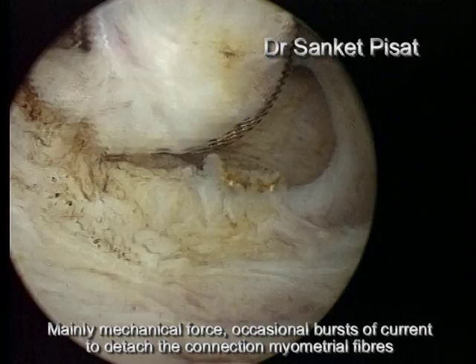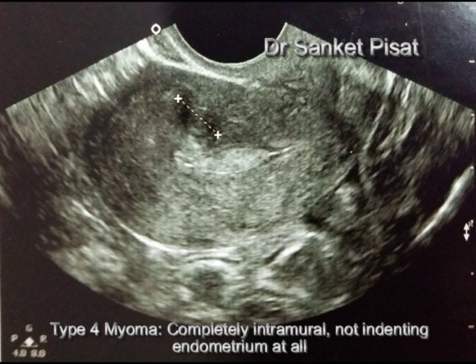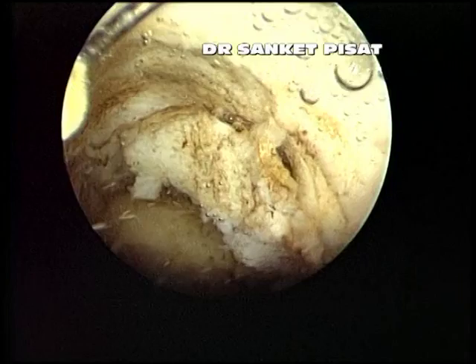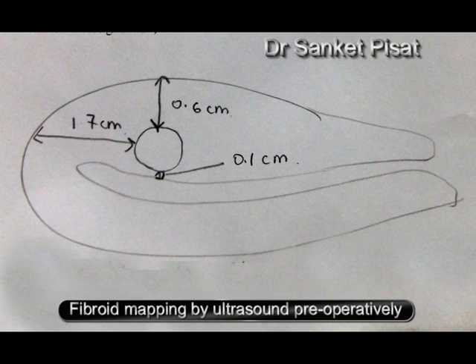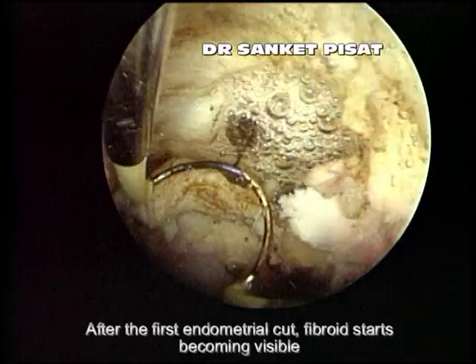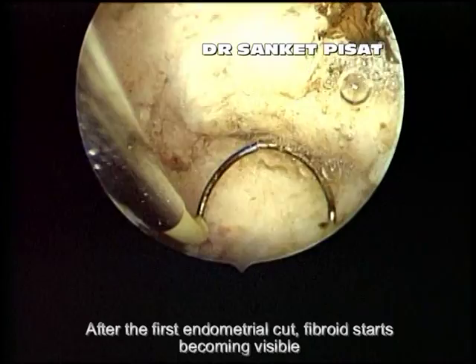This is a patient with a type 4 myoma, completely intramural and not indenting the endometrium. A good mapping of the fibroid by ultrasound clearly shows the depth of the fibroid beyond the endometrium as well as the safety margin up to the serosa. It is only after the first 1 or 2 cuts on the endometrium that the fibroid starts becoming visible as a diffuse elevation over the anterior wall.